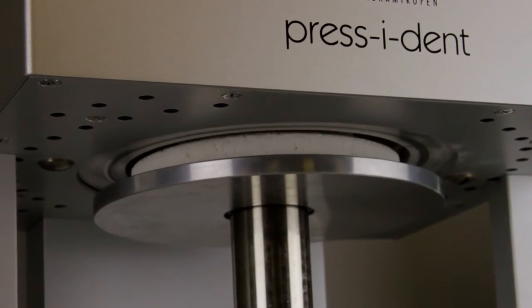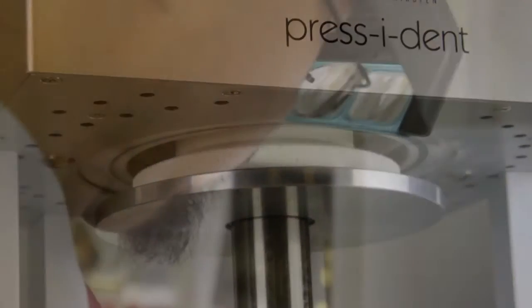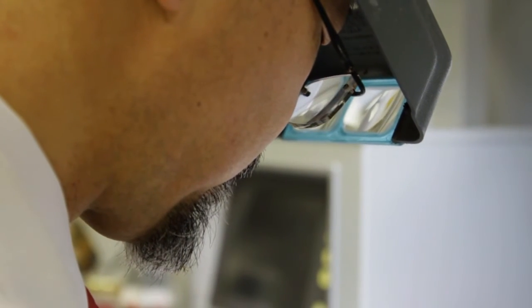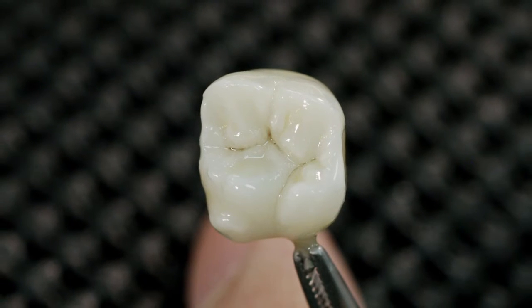Final result after one firing. The firing parameters will depend on what type of ceramic the Lustre Paste are applied to. Please see the Initial IQ Lustre Paste NF manual for more detail.